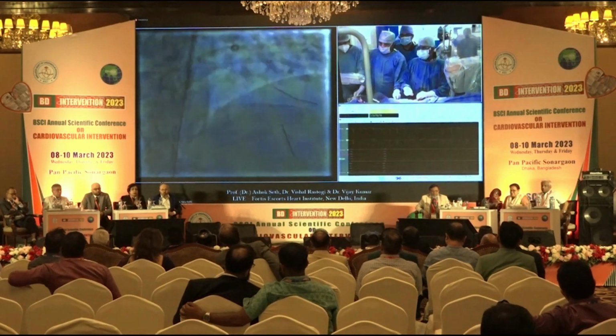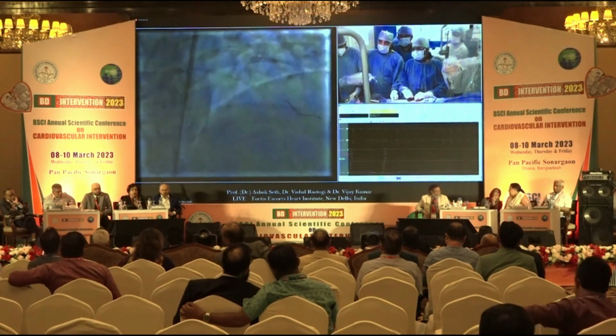Let's see if this goes at this stage, OCT. Otherwise, my strategies are clear. I will need to do an IVL even to get my stent down. See, it doesn't. Your balloons opened well. That's good. So now, yeah, and your distal OCT seems to be. So here is the IVL issue, okay? Get me the IVL, a 3 millimeter IVL. So I'm taking the, to avoid intertwining, which we have here.